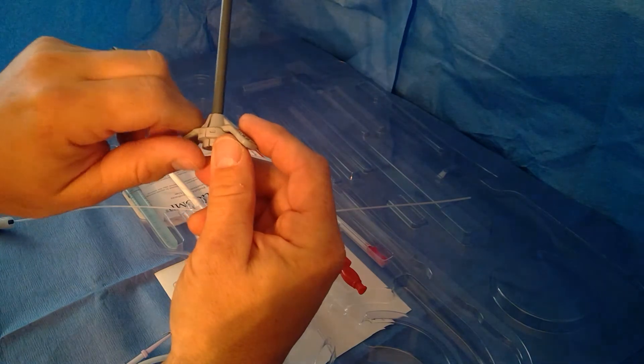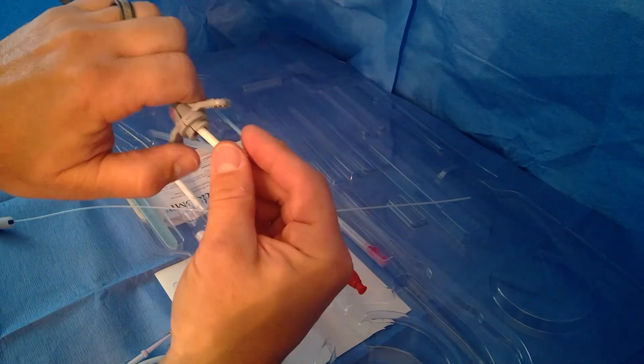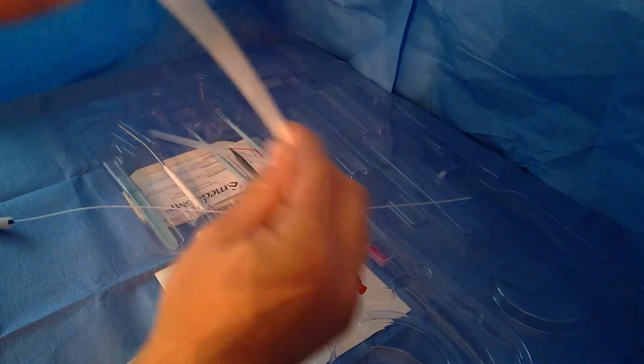And it's going to come out and split, and then you can peel the peel-away away—no problems. Again, you just want to make sure they're not crisscrossed or flipped on you.